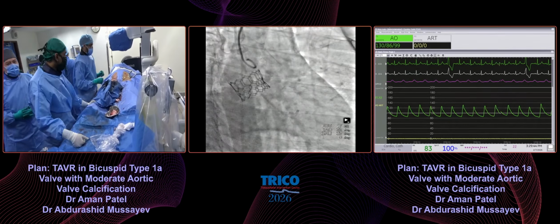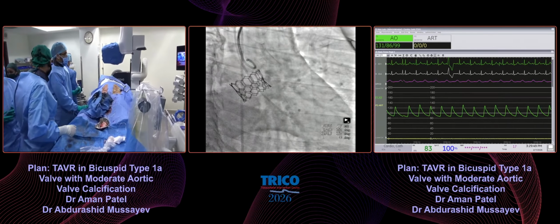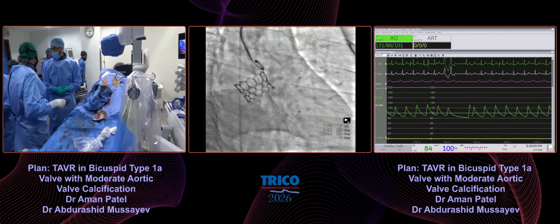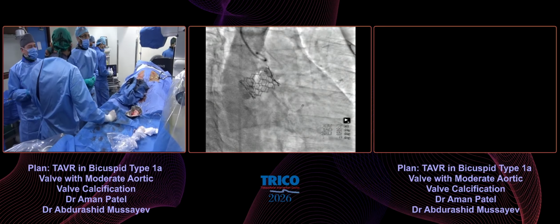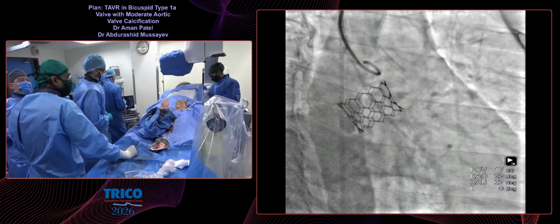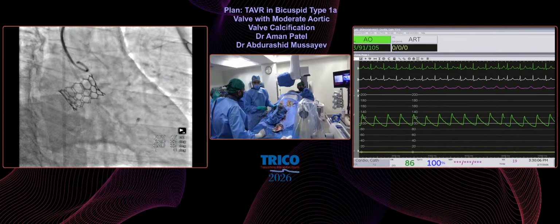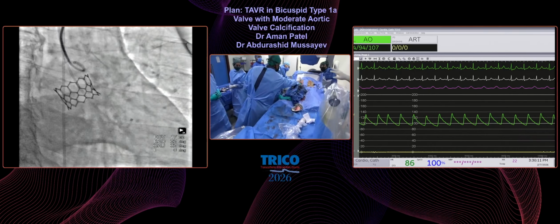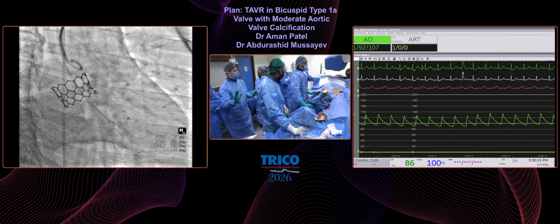Now, for the last maybe 5 or 6 months, we stopped doing echo, even. That is too minimalistic, sir. Because it is difficult to invite our cardiologists. They are all the time busy. And if we have very good hemodynamics, good angio, no changes, I think usually they are doing echo. We have an echo on standby all the time.